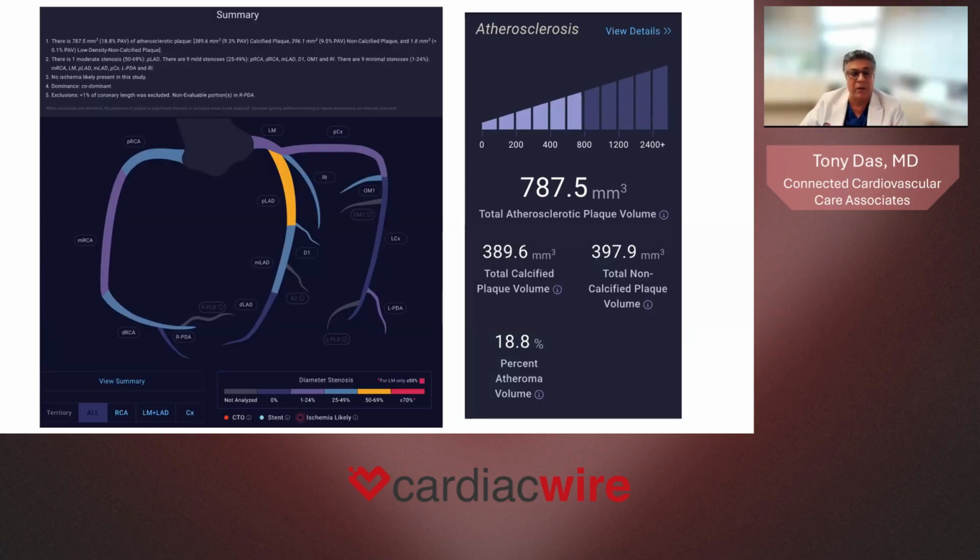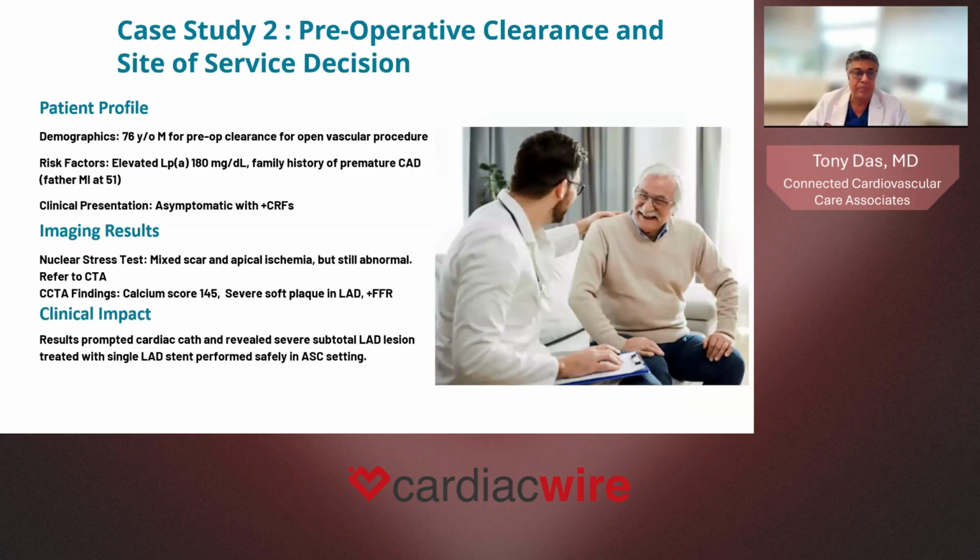This is the atherosclerotic plaque volume that the patient had, and just as we saw previously, these are things that can be followed. So if the patient has significant atheroma, the volume can be followed, and the reduction in plaque totality can also be achieved with aggressive intervention.